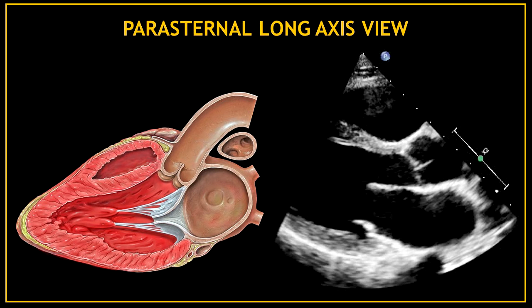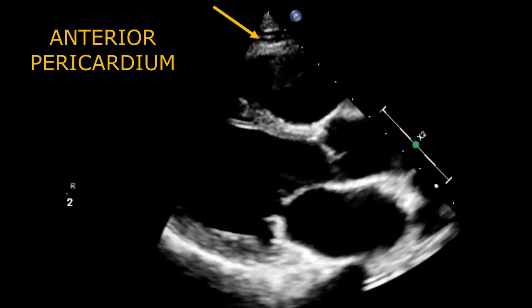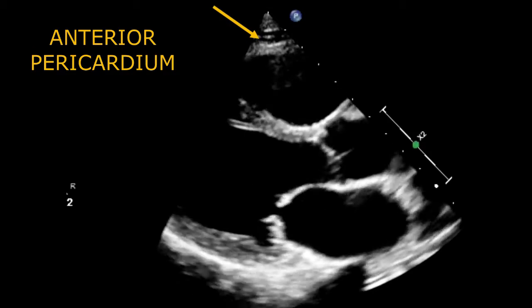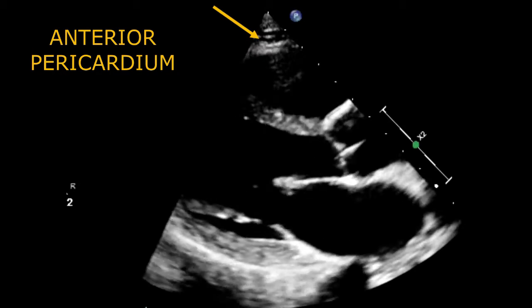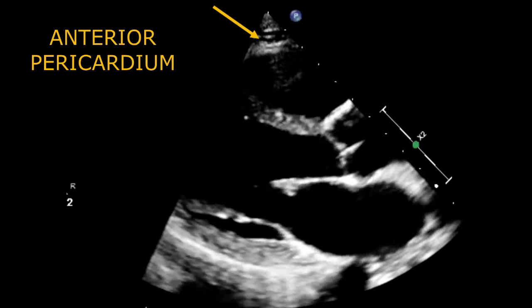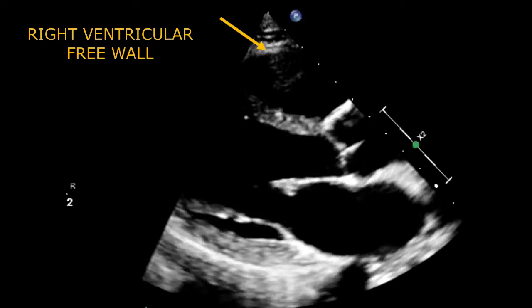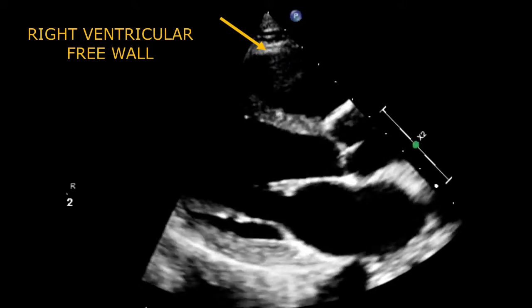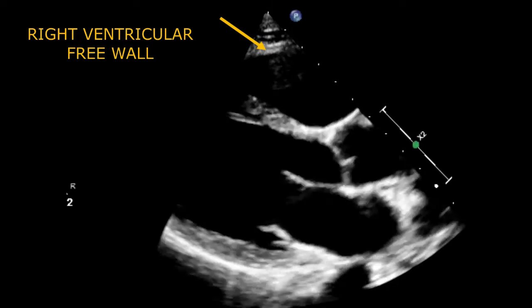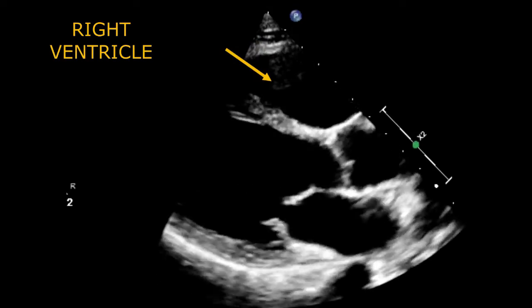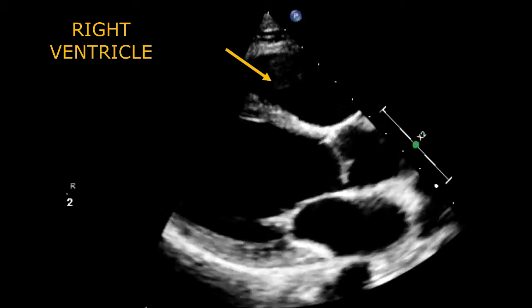Now let's watch all these structures in motion and just name them one more time. Anterior pericardium. Right ventricular free wall. Right ventricle.